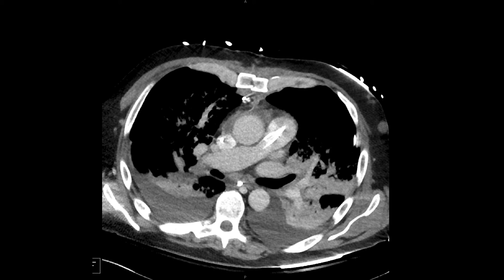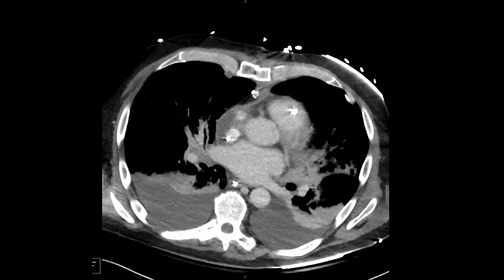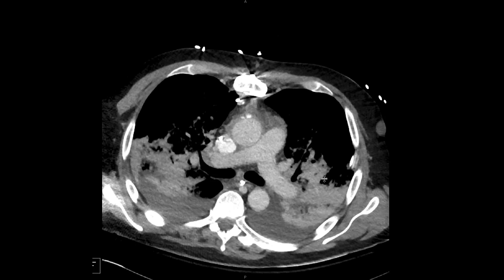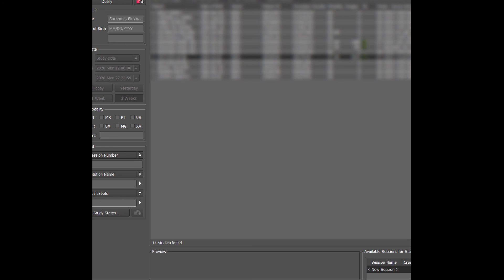On the delayed scan, the pseudo-dissection appearance of the aorta normalizes and uniform contrast is seen throughout the pulmonary arterial circulation. These delayed scans are generally performed at approximately 60 to 90 seconds, and multiple delay times can be tried. Dual-energy CT with virtual monoenergetic imaging at lower keV can help improve apparent contrast opacification. While these studies are never ideal, they can at least rule out central pulmonary arterial filling defects. Understanding device physiology is key to positioning assessment and imaging optimization.